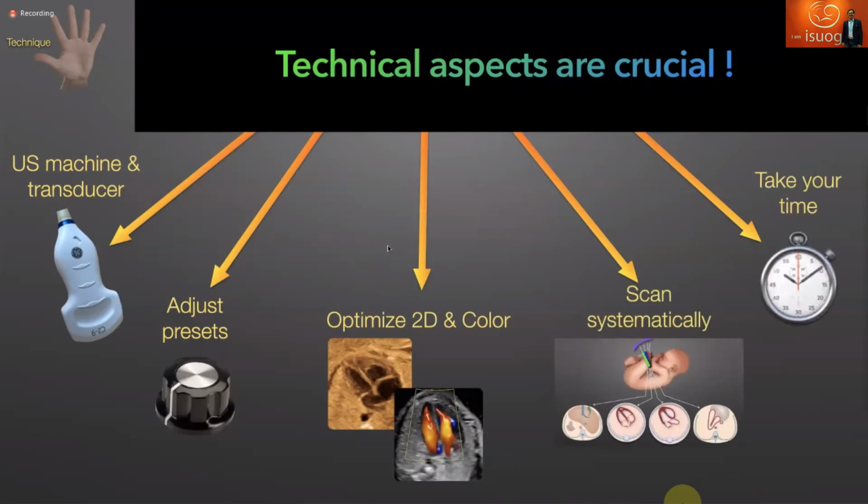And last but not least, you should take your time while you are scanning. So don't do anything in a hurry. Take your time. And you say, well, I don't have time. If you don't have time, you will miss something. It's like if you are driving, you cannot drive and do 3 things at the same time. So this is safety.